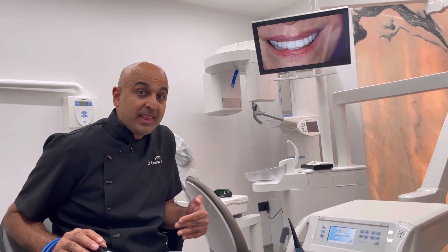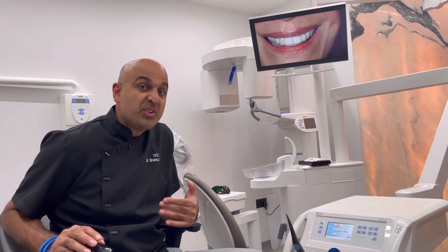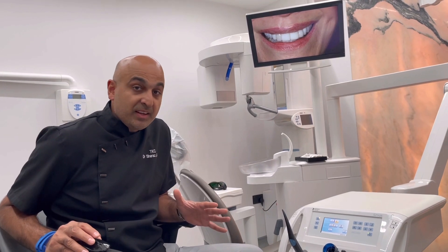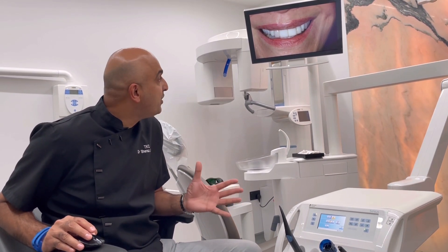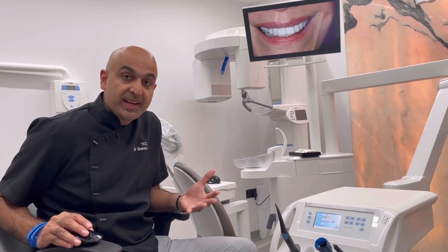Normally in smile design we're actually lengthening teeth — I always tell my clients you won't like it when I first put them on but you need time to get used to it. In this case it was the other way around; these were too long, we should really shorten them, but she wasn't interested. To make them look natural at that length takes a lot of skill, so that's why we went for stacked veneers. She said for now she just wants the front six done, not all of them. She also wanted to keep a similar color but without the piano-keys monolithic blocky porcelain, so we agreed on graduated color, keeping it quite bright.